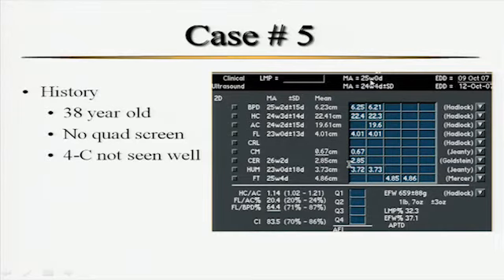So she's supposed to be 25 weeks. Well, the BPD is measuring 25 weeks. Head circumference is measuring 24 and 3. AC is measuring 24 and 3. Femur is measuring 23. Cerebellum is measuring 26. Humerus is measuring 23. Foot is measuring 25. So look at how both the humerus and the femur length are measuring smaller. Everything else is measuring within normal range for the assigned gestational age.